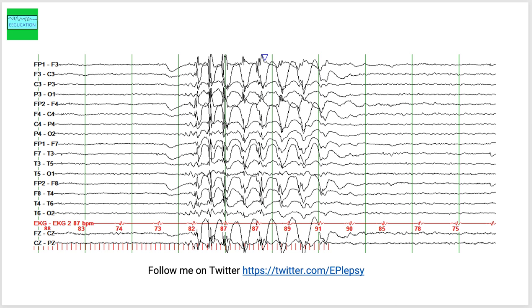Many times the photosensitive response is only seen at a certain frequency. So if a person has photoparoxysmal response at 16 Hz, meaning at 16 flashes per second, it does not mean that you will see a similar response at 10 Hz or 8 Hz. Certain conditions such as ceroid lipofuscinosis has a specific response at a very low frequency, such as one flash per second.